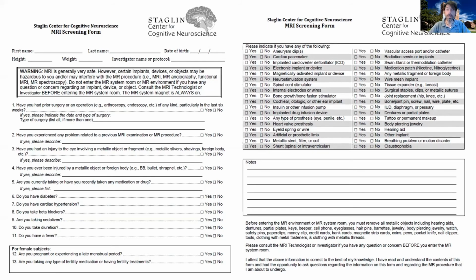However, if somebody responds yes to any of these, it is a cause for follow-up. So you want to make sure that you determine exactly what the issue is and that you are able to establish that the particular device can safely enter the MR environment.